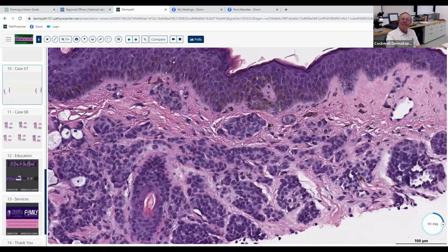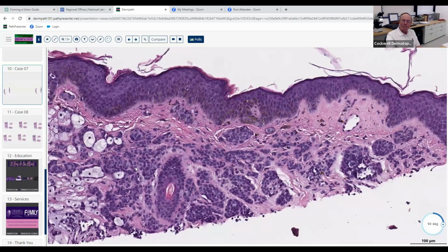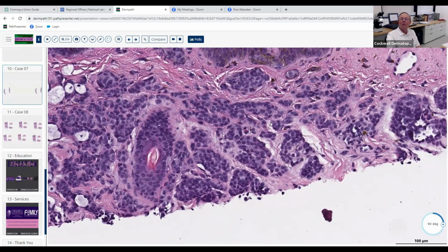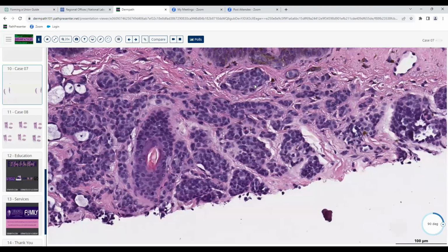Right. Okay. Wow, how did I not have that word in my head? Okay. So what kind of lesion is this part over here? It's a benign neoplasm with melanocytes. And what do we call that? Benign neoplasm. Melanocytoma? I don't know. Well, we don't like that term very much. But what's the most common benign melanocytic lesion that everybody's got on their body? Oh, like a lentigo or a nevus? Nevus, melanocytic nevus, mole.